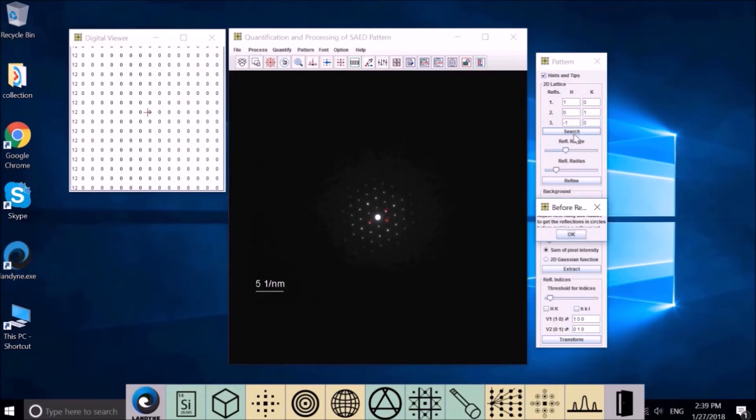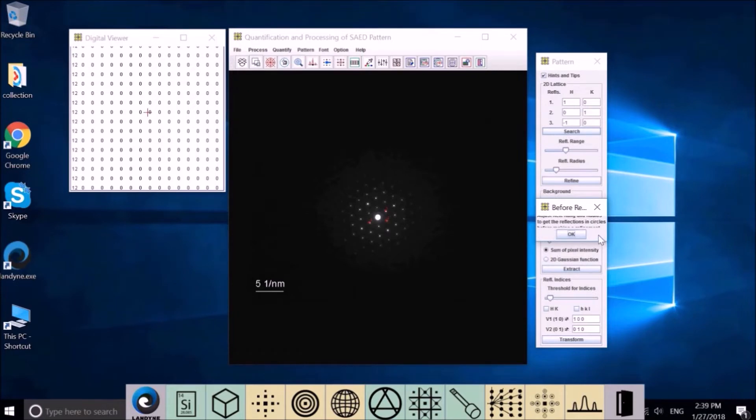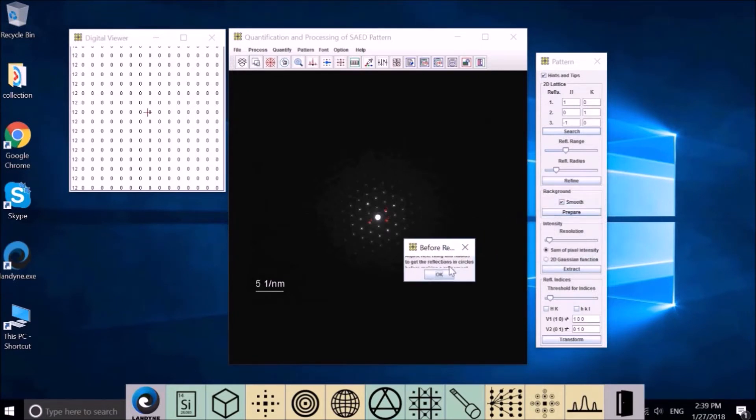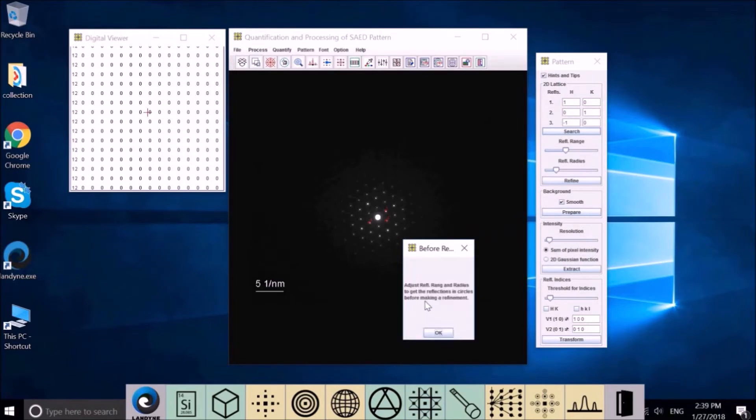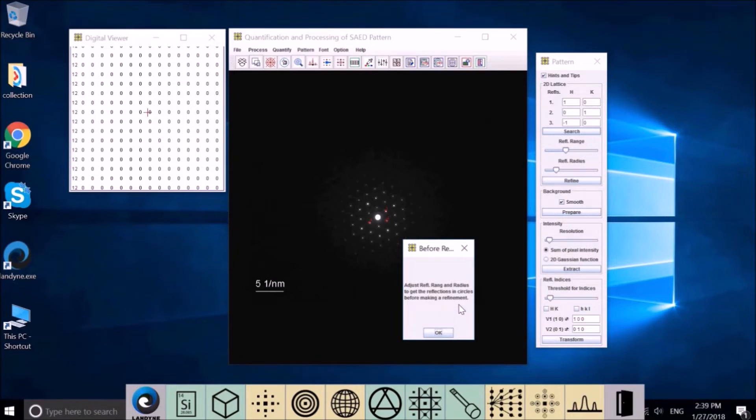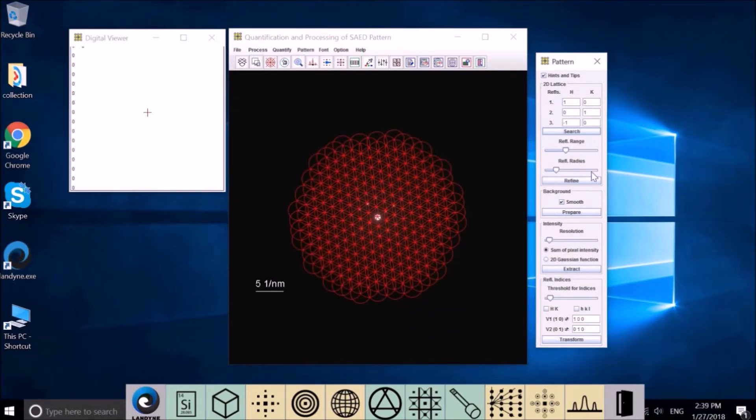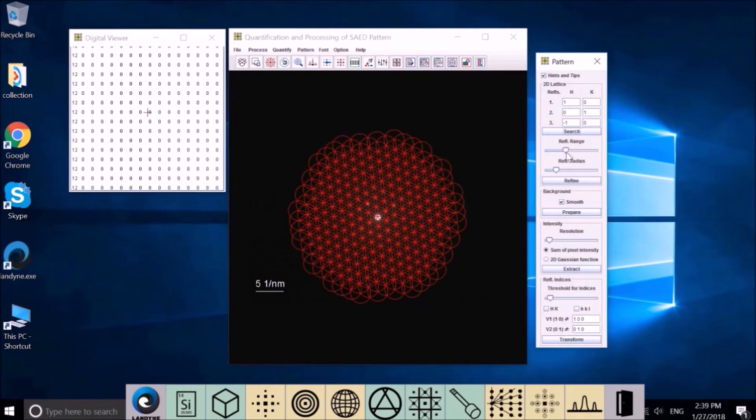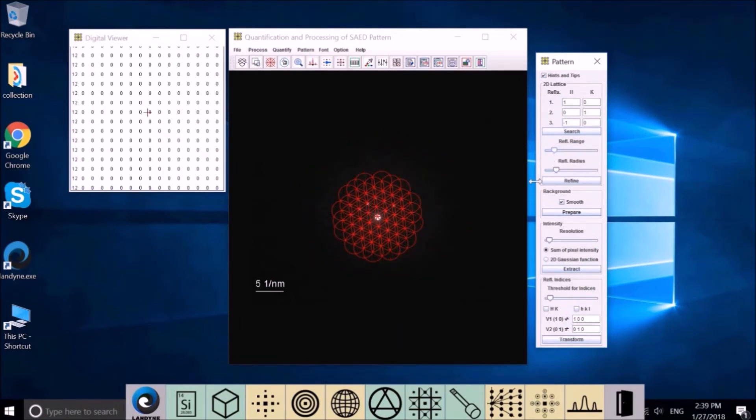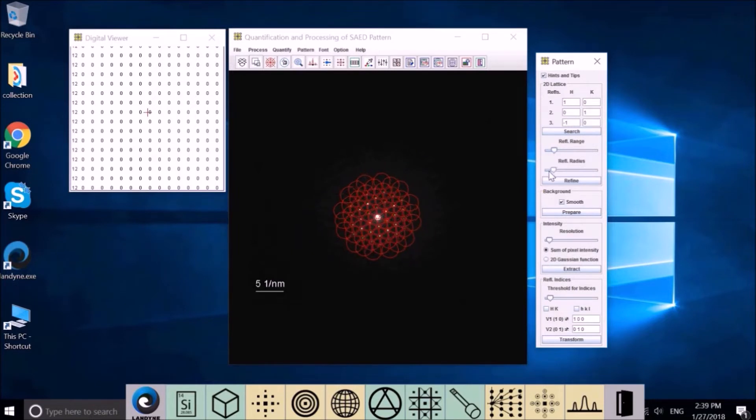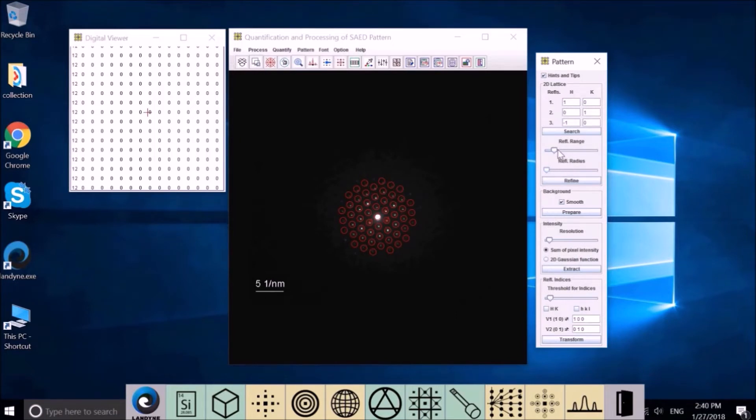Before you search, you can define how large an area of the diffraction you want to search. I'll show you a hint. It says adjust the range and the radius to get the reflections in circles before making refinement. We make this too big, so we'll adjust this one, and this one.